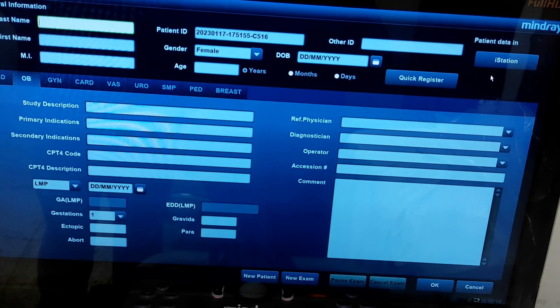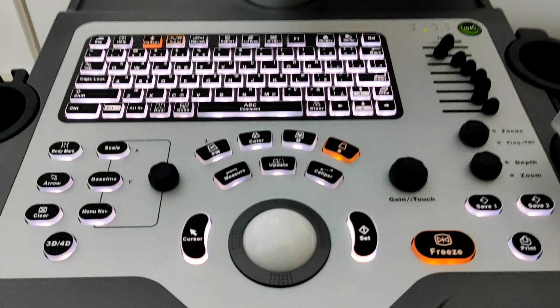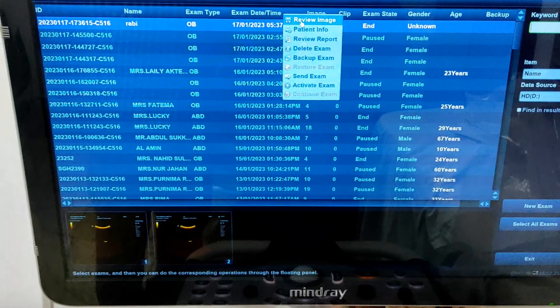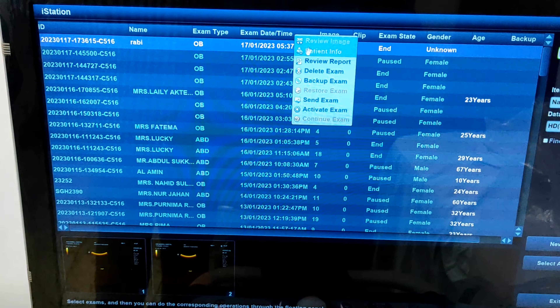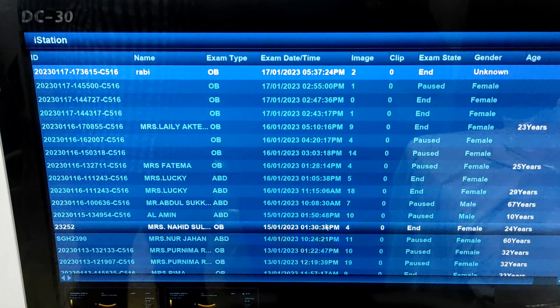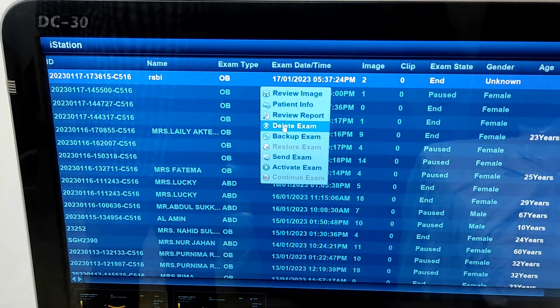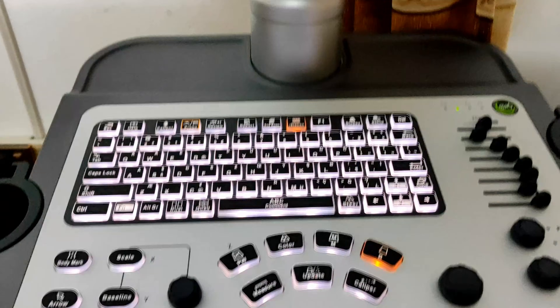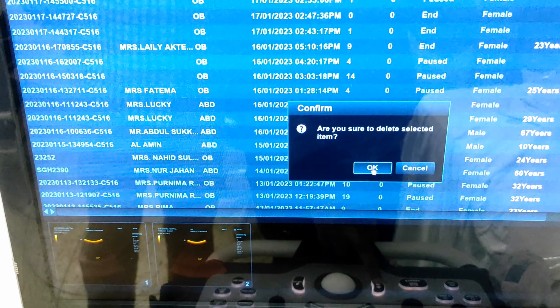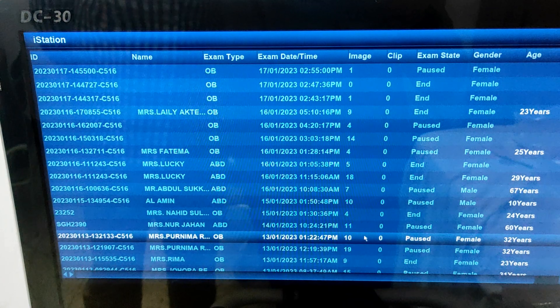If you want to see previous patient information, click on the iStation icon. This will show the information and images available for previously examined patients. Select a patient record and click delete, then press your save button — this will delete the previously saved information. Click OK. In this way you can delete previously saved information, which will help you to free up storage.